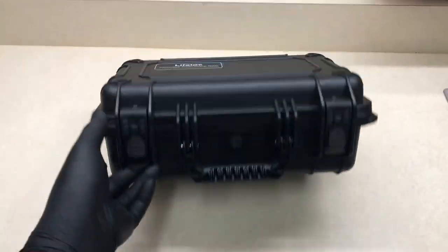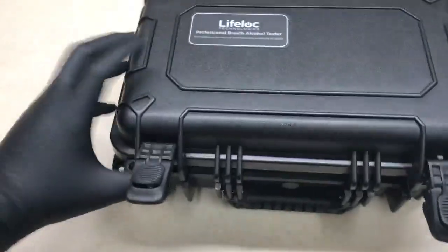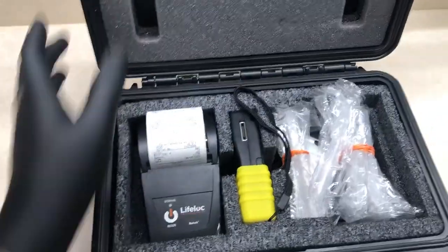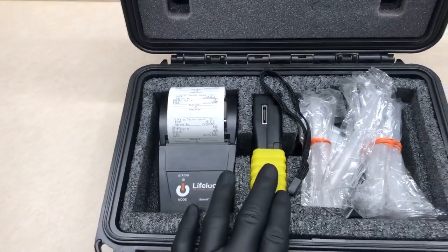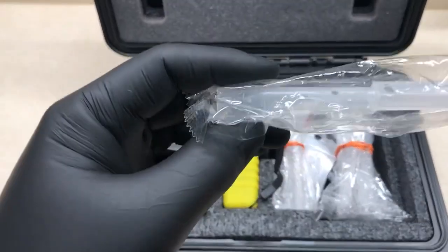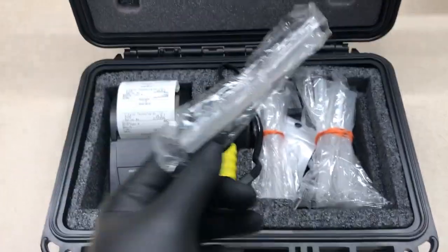So what you're going to need is you're going to go and look for this box. It's going to be located somewhere in the lab, Pelican cased. So all you're going to be doing is opening this bad boy. What you're going to get in here is your printer, your breathalyzer, and the straws that the patients will be blowing in.